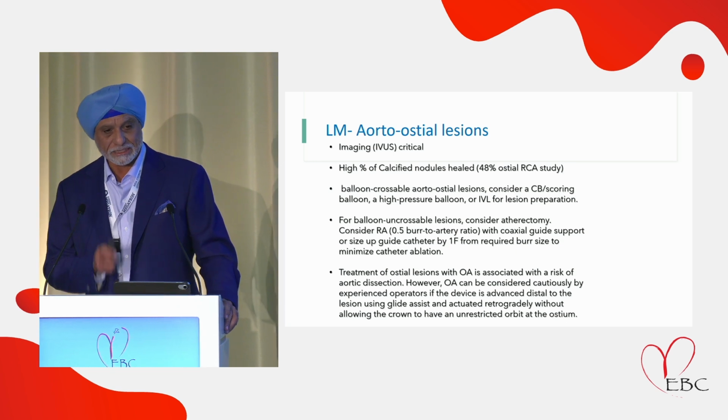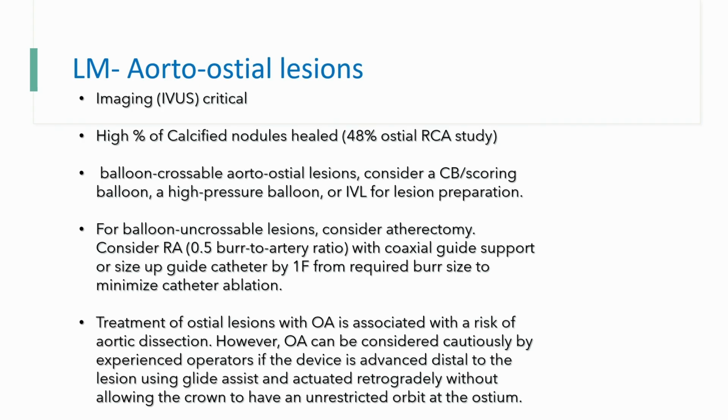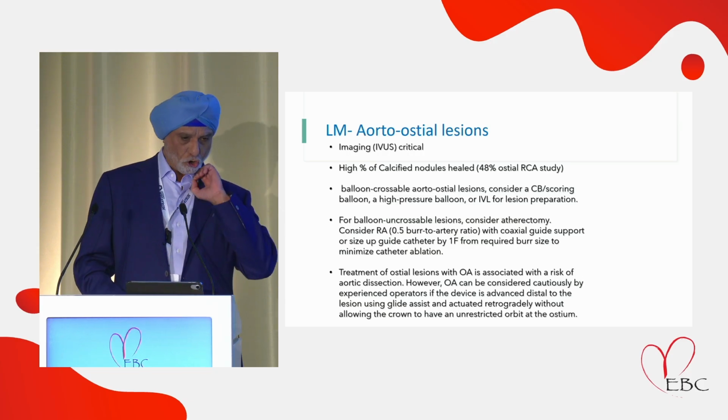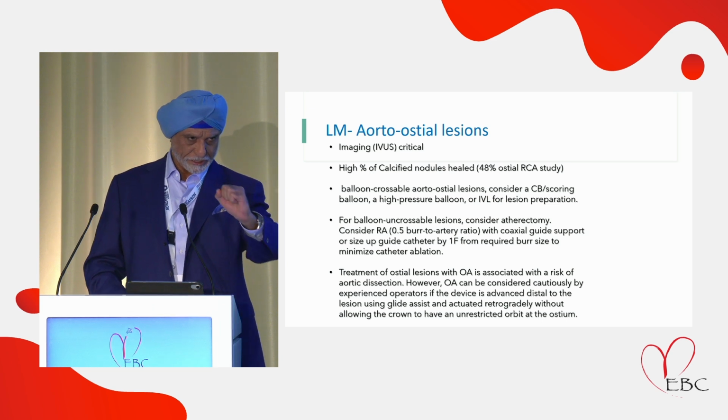Ostial lesions are important because ostial lesions are highly calcified. The ones that are calcified are usually nodules. Even in left mains, this was an RCA study, but the left main study showed that at least about 50% of them are nodules. I think we need to treat them differently, and IVL is very, very important in that. Especially if you're using orbital or rotational, make sure your guide is coaxial, and if you're doing orbital, go distally, then come back.